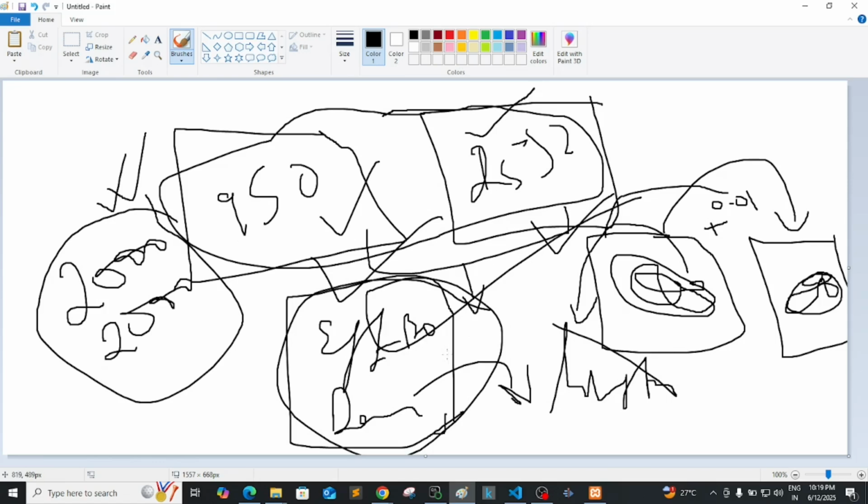And you can do a combination like this, and you can work on that. We can try EfficientNet and MobileNet as a new combination. You can go with DenseNet and EfficientNet, but you need to train for more epochs when you increase the complexity of the model by combining 2 to 3 models as hybrid models.